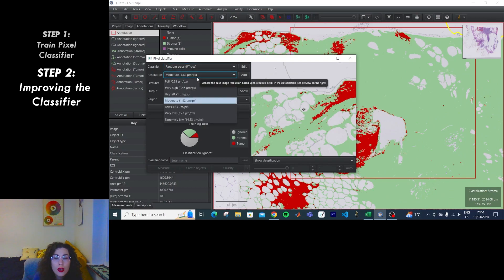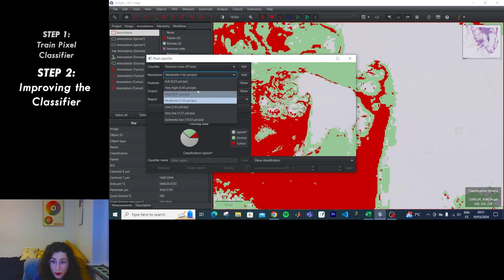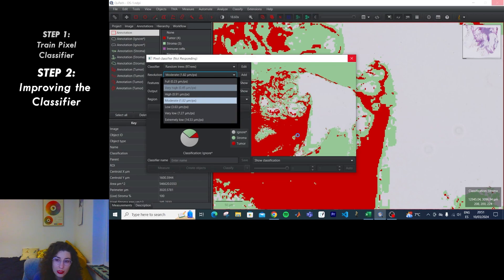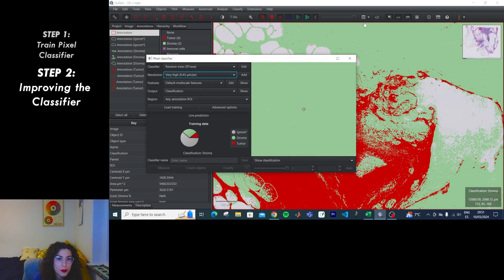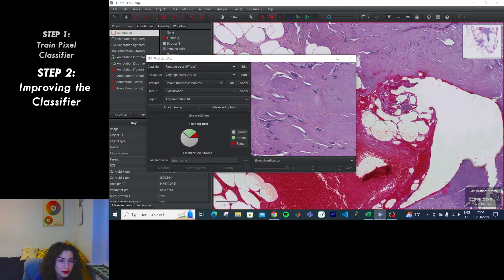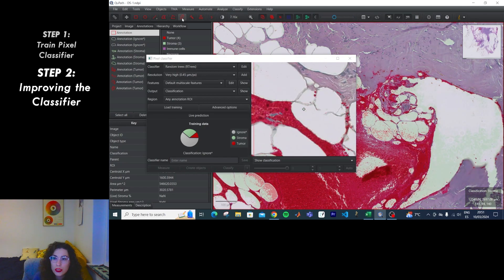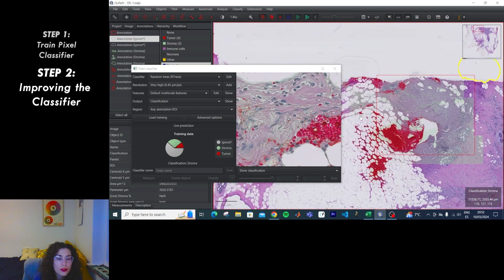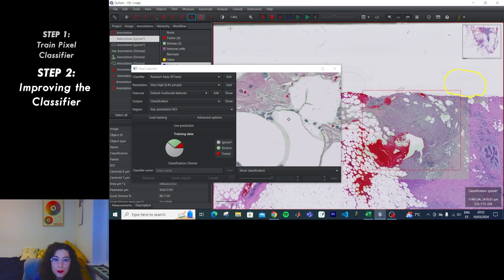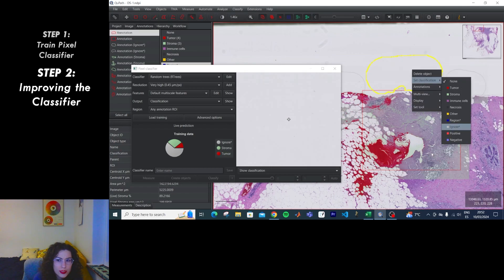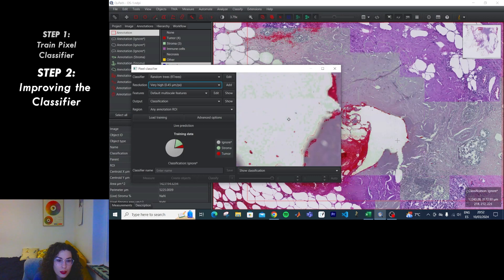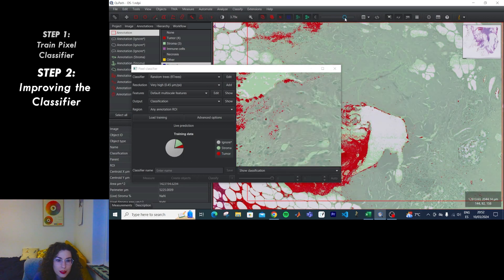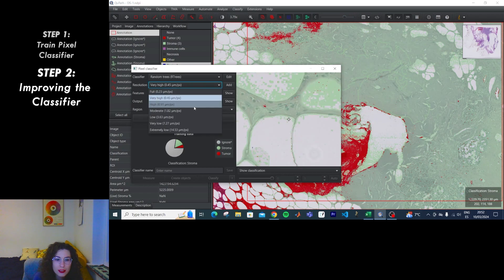We can also control the resolution, which is obviously going to affect performance. If we go to very high resolution, does it break my computer? It tries. But it doesn't work as well anymore — classifying a lot of background as stroma. We'd need more annotations, including more ignore examples. It's suffering from the change in resolution — not responding. So maybe in this case it's better to not have a very high resolution.